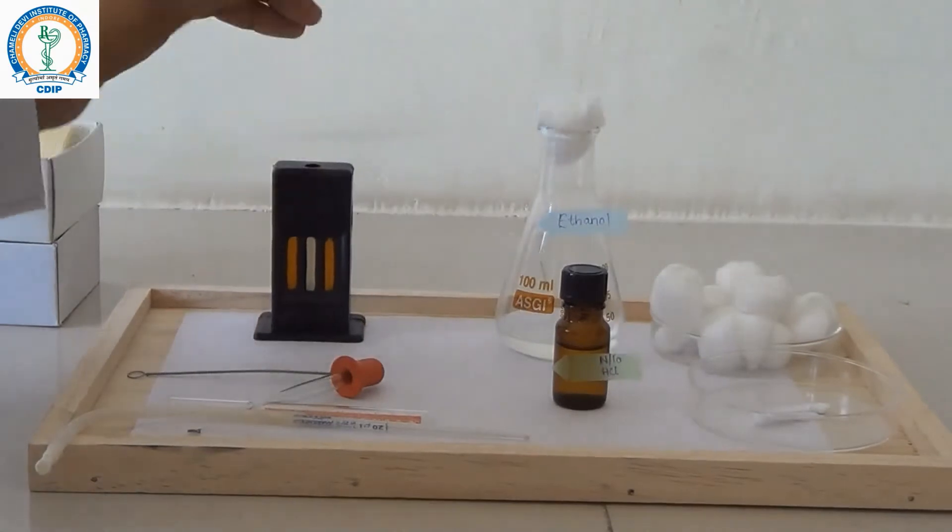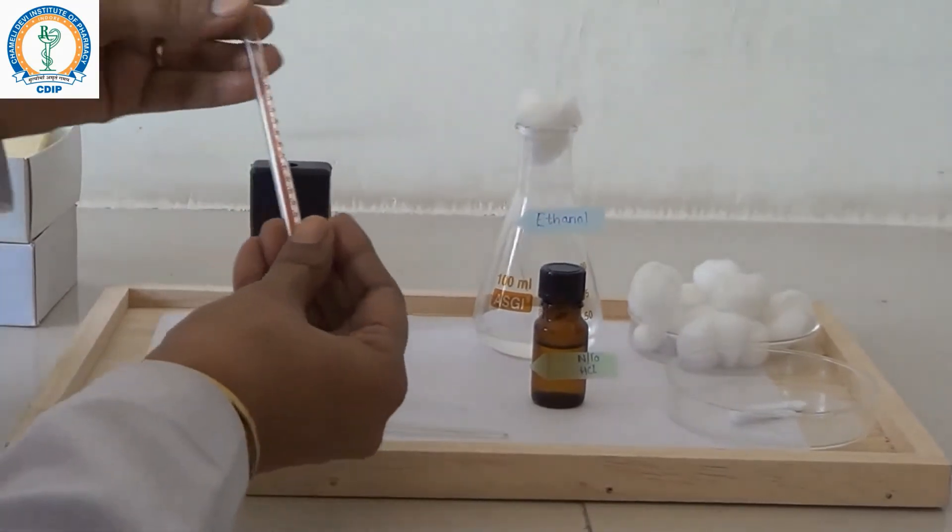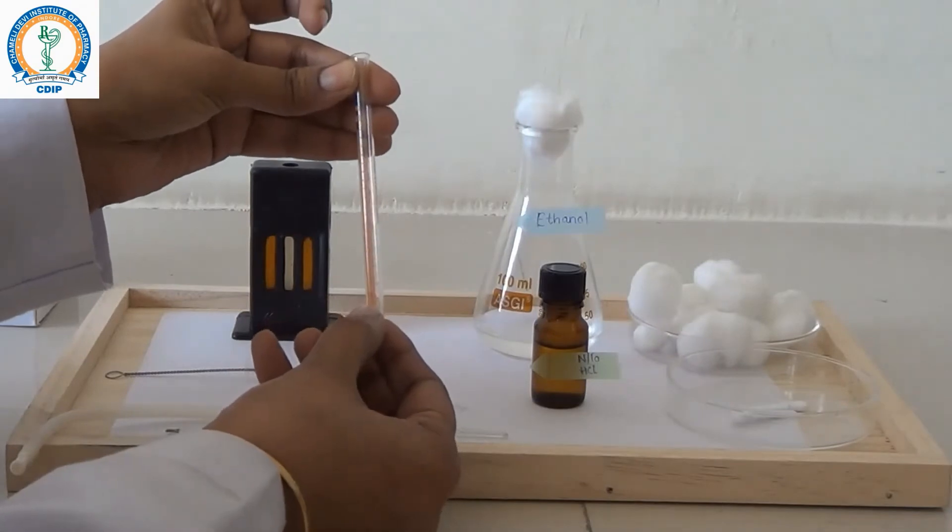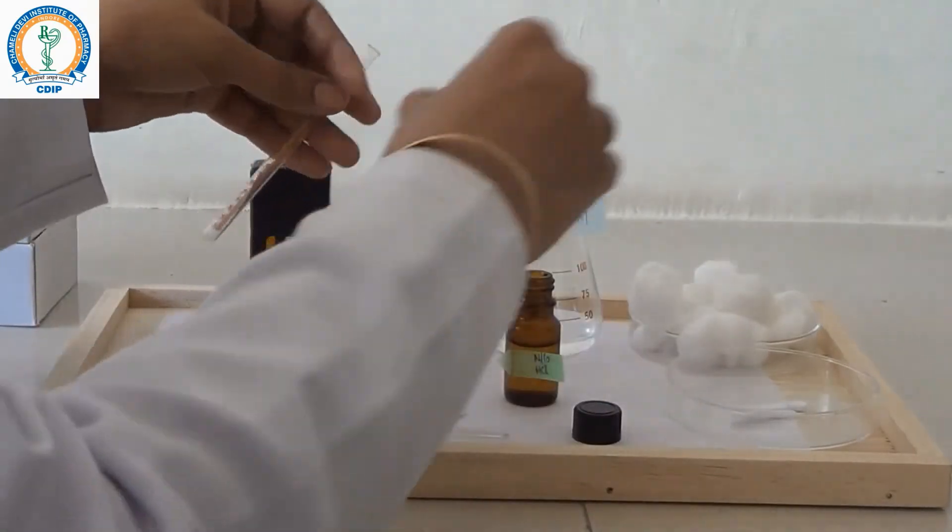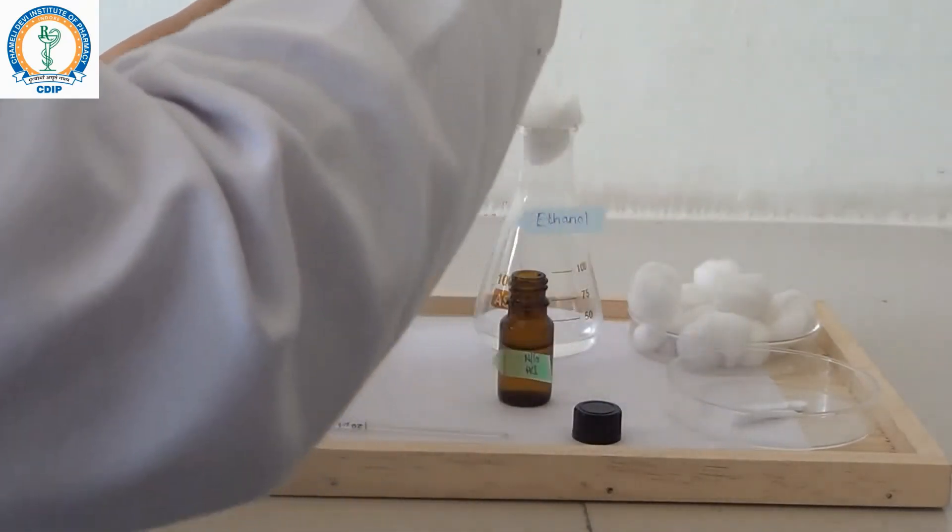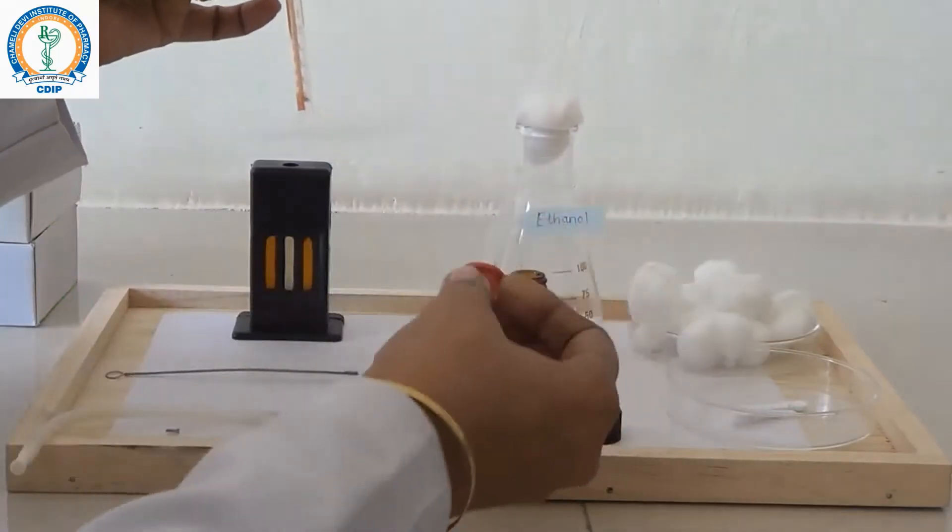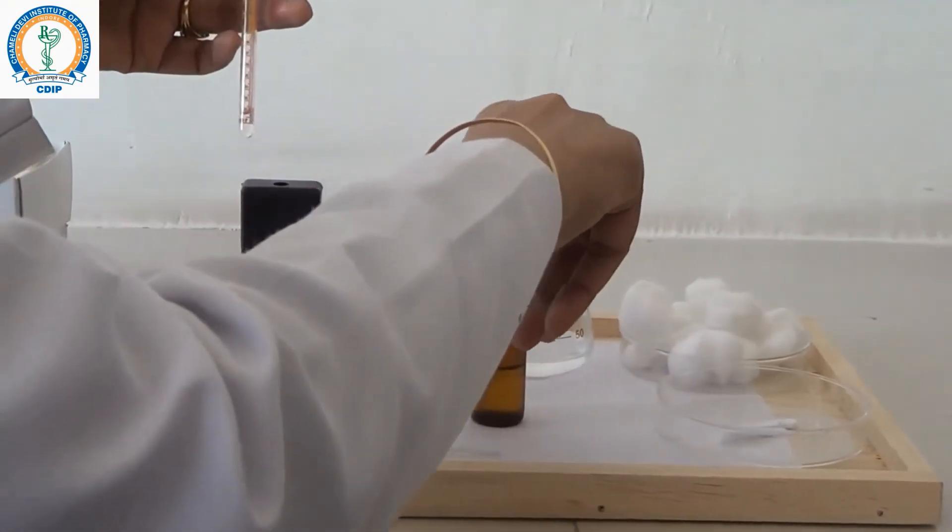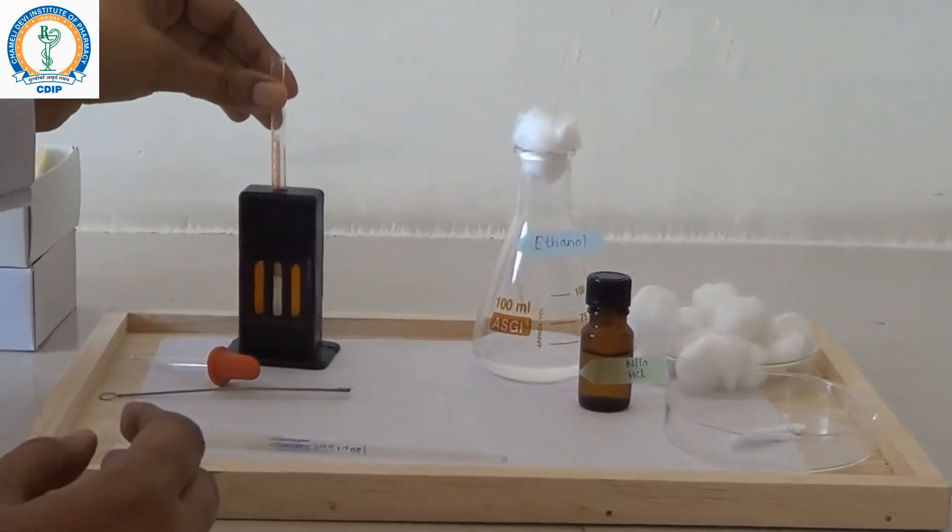Firstly, before pricking the finger with needle, we first put N by 10 HCL up to mark 2 in graduated tube with the help of dropper. Put this graduated tube for a while in the comparator stand.